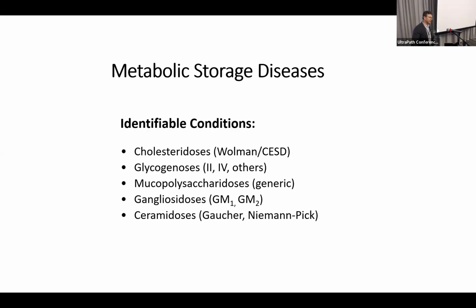I barely mentioned some of the small round blue cell tumors, these undifferentiated congenital tumors. Those are the ones that give pathologists the heebie-jeebies, right? Because by light microscopy, they all look exactly alike. We have lots of different tests and genetic testing now, but pretty much every one of them has a specific EM finding, whether it's a Ewing sarcoma, rhabdo, or neuroblastoma. All of these, we can do a good job with.